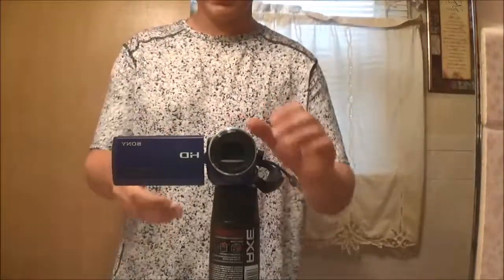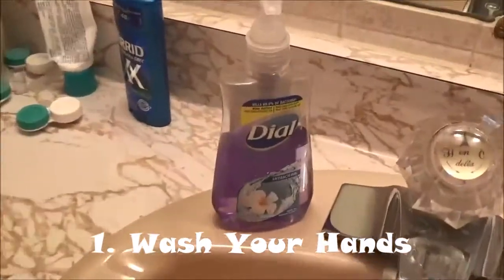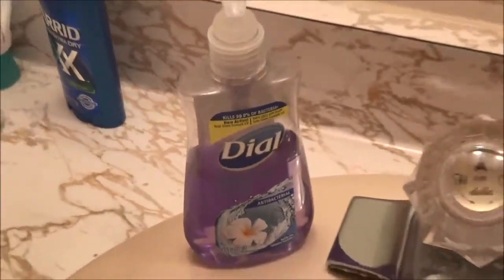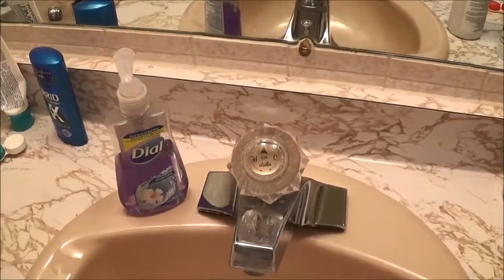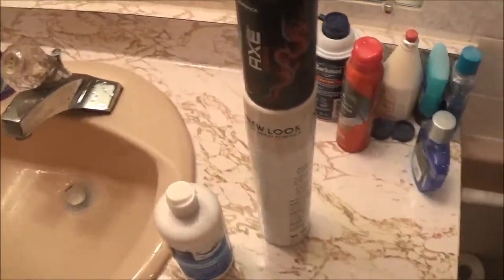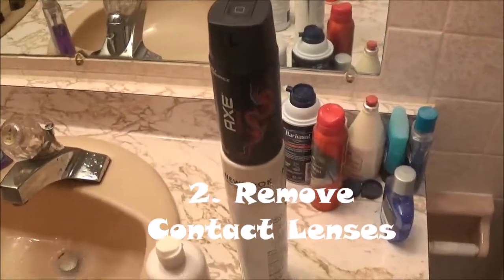But anyway, we're going to get right into the tutorial. So first step is, you're going to go ahead and, like I said, use the same soap I used before. I just moved it to my dad's bathroom, it's the Dial, and you can use any kind of soap. I'll be right back as soon as I wash my hands. Alright guys, so once you have successfully washed your hands for 30 seconds to a minute, now we're going to actually remove the contact lenses.